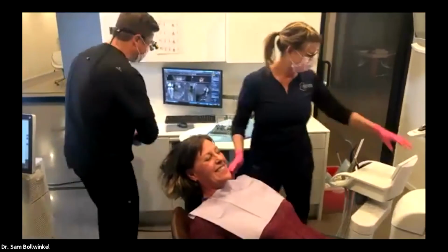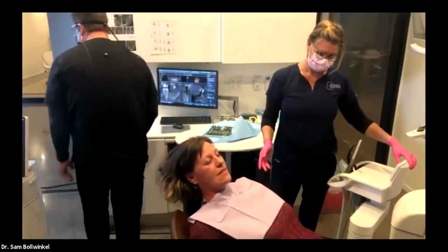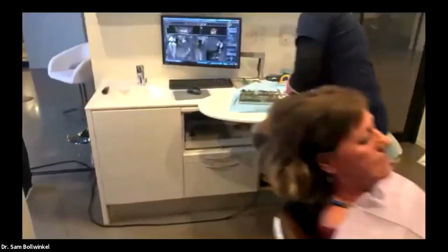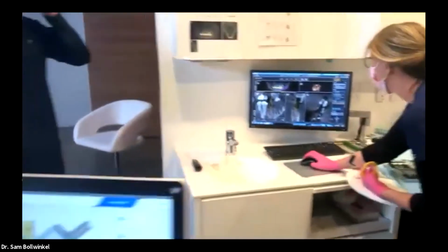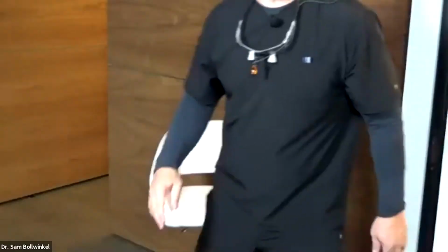Thank you so much. All right, we're going to get some X-rays, and we'll show you guys those X-rays as soon as we get them up. But let's step out. We're going to go out here and queue up and go through our summary. So a 10-minute implant takes us to 6:45. We've got 15 minutes. Let's sit down here, turn my light off, my mic on. Awesome. Let's shoot up here. And I'm going to go ahead and close this. As Kim finalizes our patient, we'll get the X-rays and we'll demonstrate.